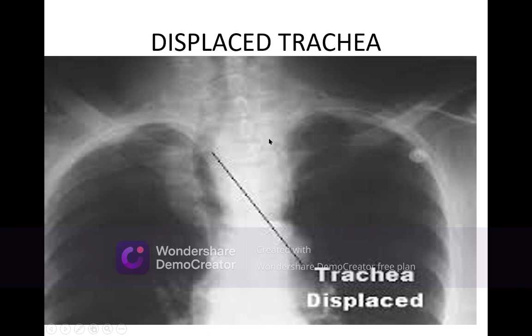When it is pushed, it is due to a tumor, pneumothorax, or excessive pleural effusion. Pulling effects occur in case of collapse on the same side. Collapse, number one, a very important condition. And the second one is fibrosis, the cicatrization or contraction of the fibrous tissue.